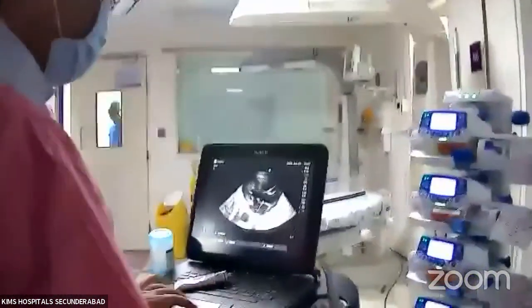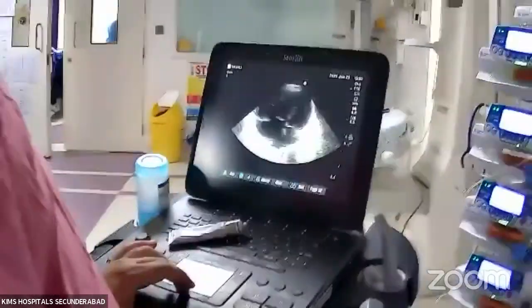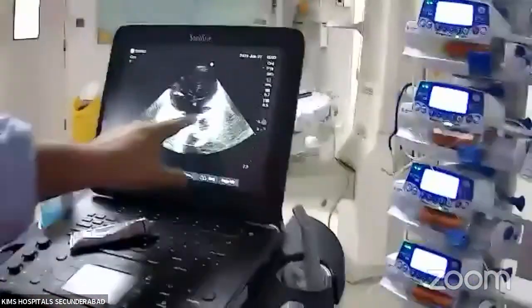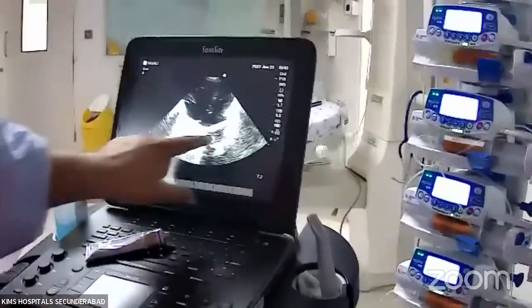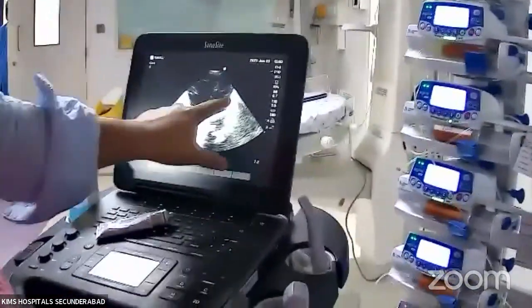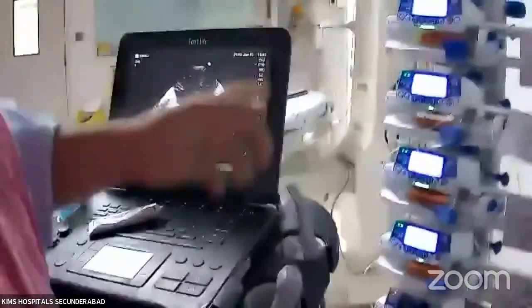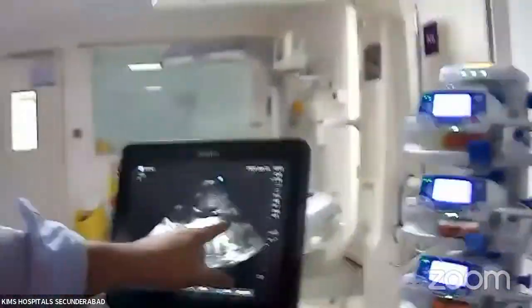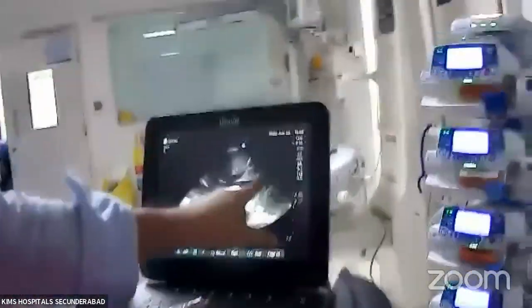Okay, and in the same way, there is one more clue I will give you. Whenever you are seeing the LA, the aorta will always be just behind that. So there is no gap between the LA wall and aorta. But if the gap increases, that is suggestive of TAPVC. If this ridge is not seen, that is more suggestive of TAPVC. So you have to get this clue from that. And in the lower view, I told you, if there is only IVC and aorta, there is no third vertical vessel in between. That means there is no descending pulmonary vein. So like that you see.